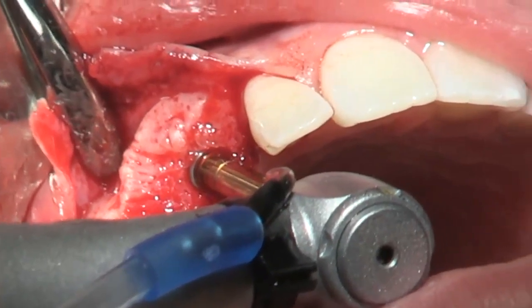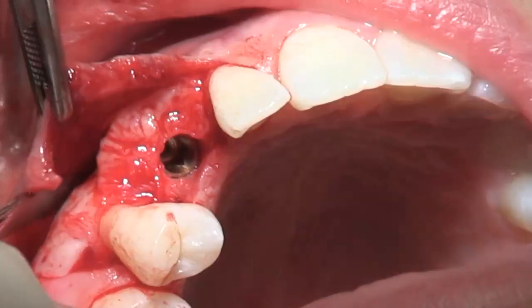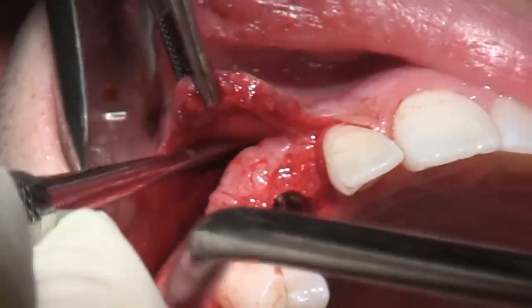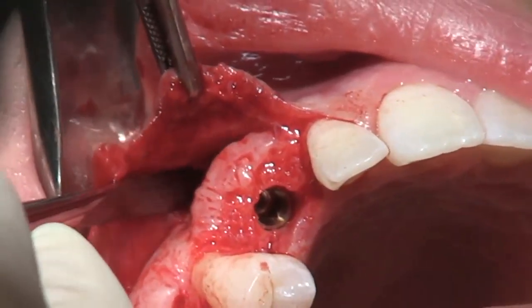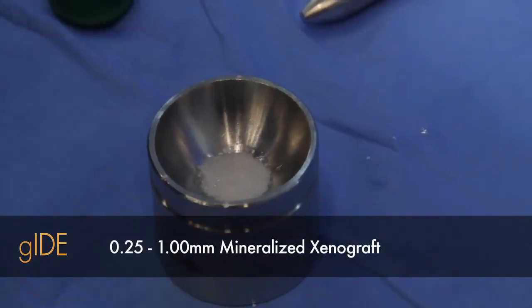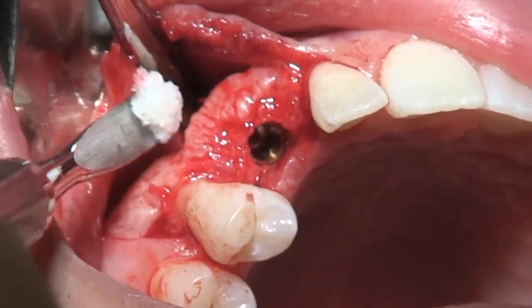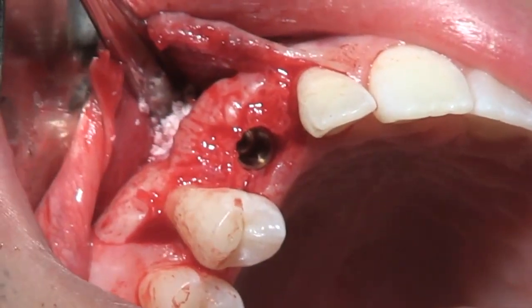Here's the final position, right at the buccal bone level, and showing a good thickness of buccal bone, and then elevating a full thickness flap to allow sufficient space for the bone graft to be placed around the apex of this implant. The bone graft of choice here is a mineralized, particulated cancellous xenograft, which is being inserted into this bony deficiency and on the exposed apex of the implant.